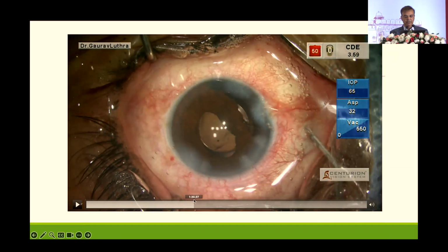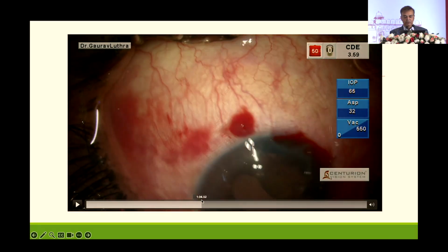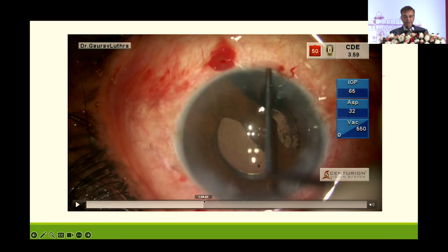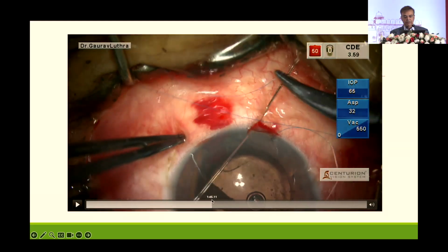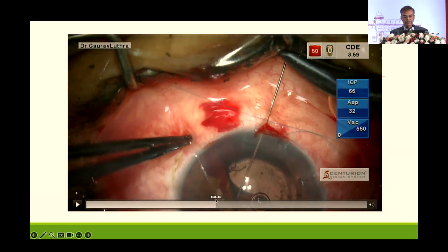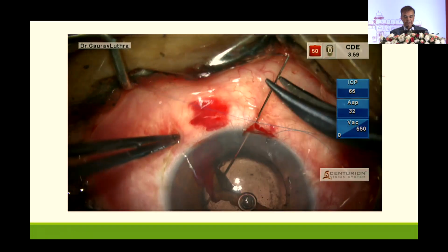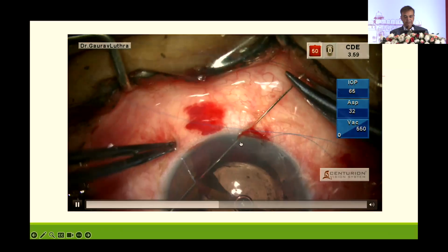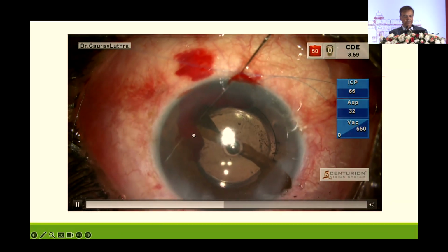So you can see that I'm going to create 3 pockets, in the small scratch incision at the limbus, and then dissect with a crescent into the subconjunctival sclera, and then pass the suture. Now this is a learning experience. This is again a surgery done a few years back. As I passed the needle through that iris, I was not holding it. Now that's a big blunder.